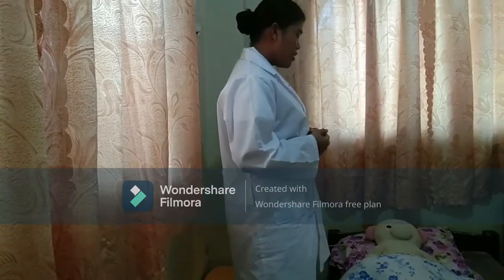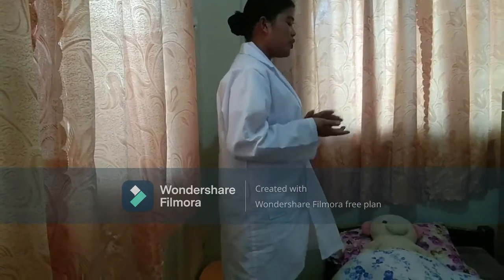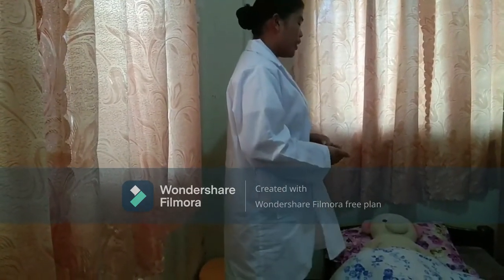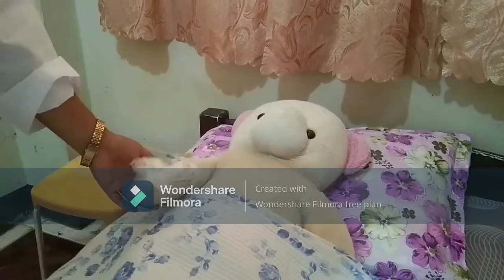So, Mrs. Jones, now we are going to discontinue the intravenous infusion because your hydration status is now at a satisfactory rate.